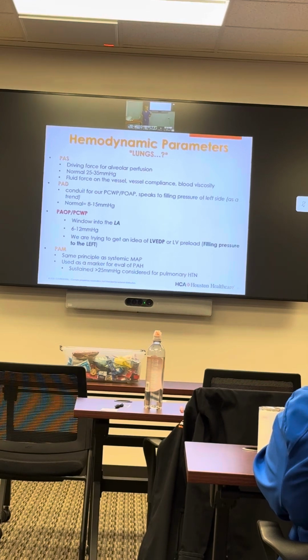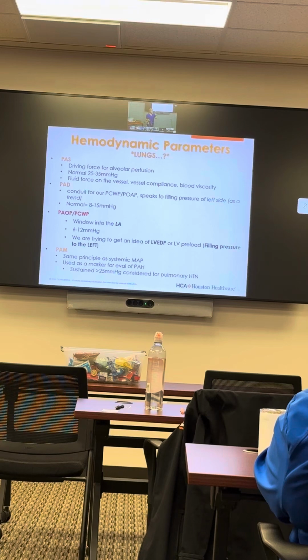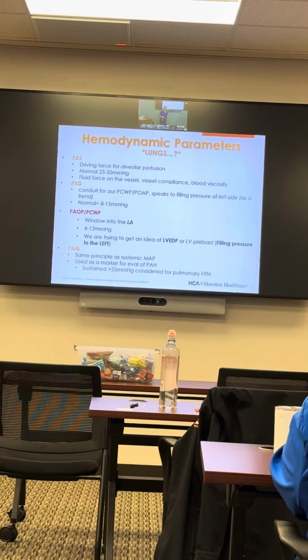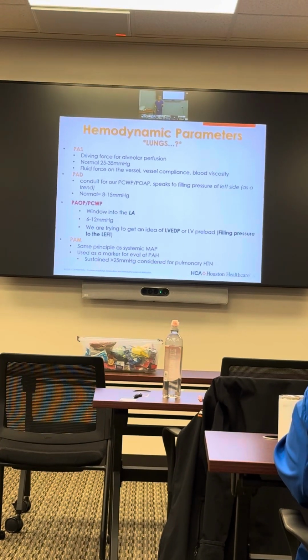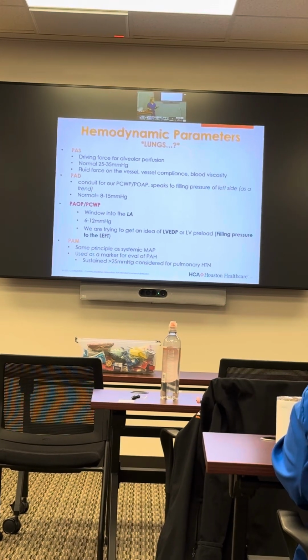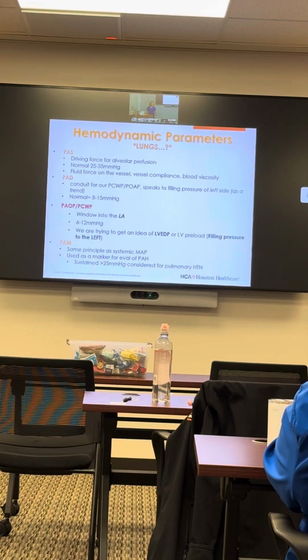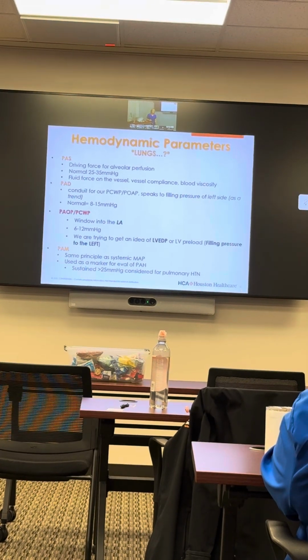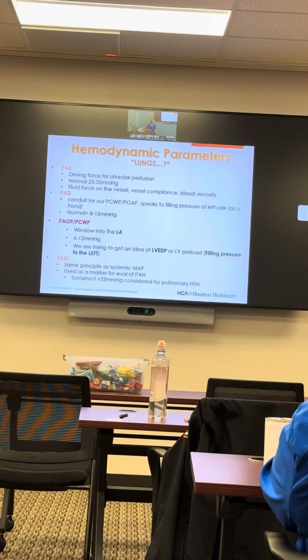So, we are though in an artery, which means you get a PA systolic. You get a systolic number here. You get a diastolic number here. It's in an artery. But the key function is that we get a pulmonary artery occlusion pressure or a pulmonary capillary wedge pressure, because it's anatomically impossible to feed a catheter all the way over into the left atrium. Be a bad idea, creates PFOs and such. Not a good plan. Would you agree?